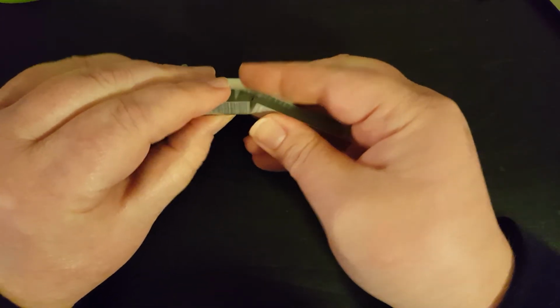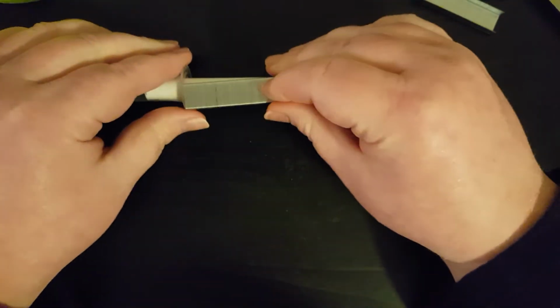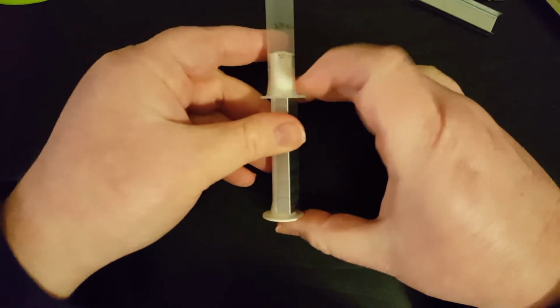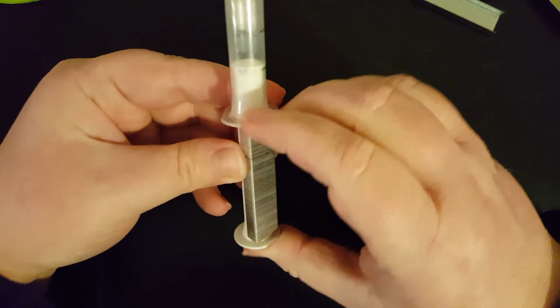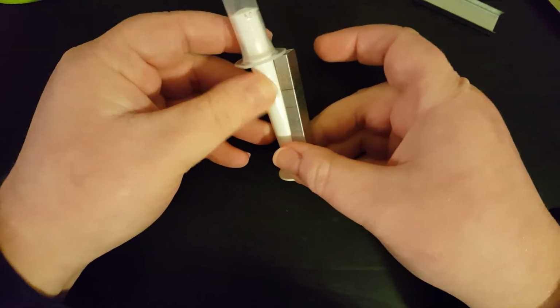So I'm going to break off our staples real quick. And we're going to attempt, and see, that's a nice fit. And so we have a good snug fit, and it's pretty precise on our accuracy. This is something we could use.